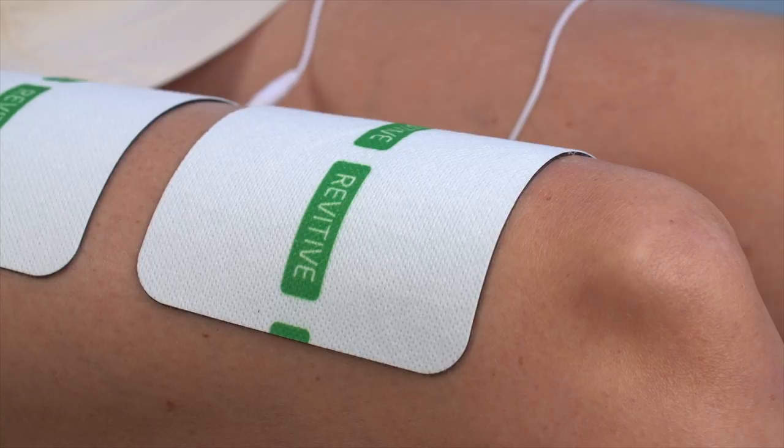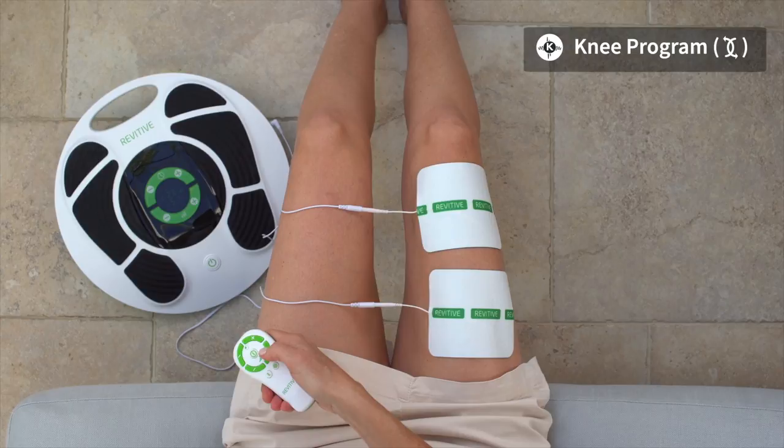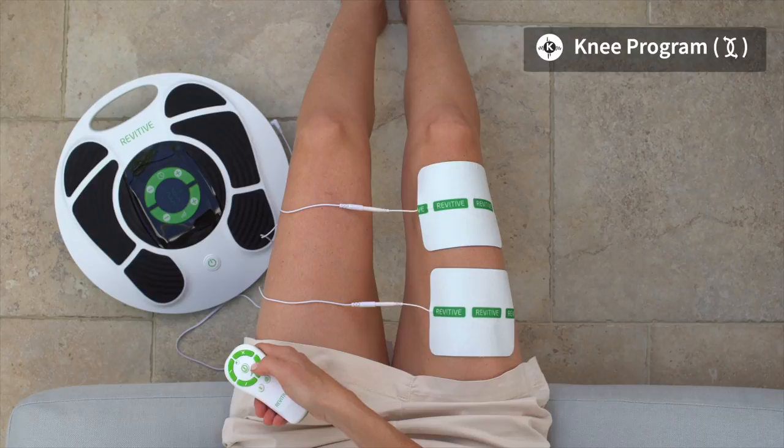Using the remote control, turn on the device. The time will read 20 minutes and the Knee Program symbol will be displayed. Start increasing the intensity level. At the start of the program, there will be 30 seconds of stimulation to help you set the right intensity level, followed by a rest period of 30 seconds when you will feel no stimulation.